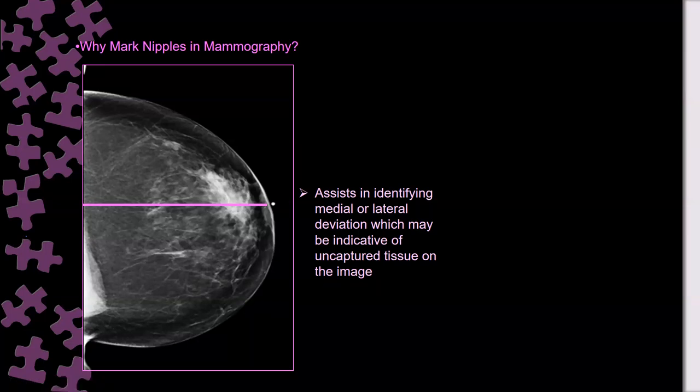No. Because the nipple is not centered. It should be positioned centered. The nipple here is tilting laterally. So it can also help us make sure it is indicative of uncaptured tissue, that this position indicates that some of the breast tissue is not included in this image.